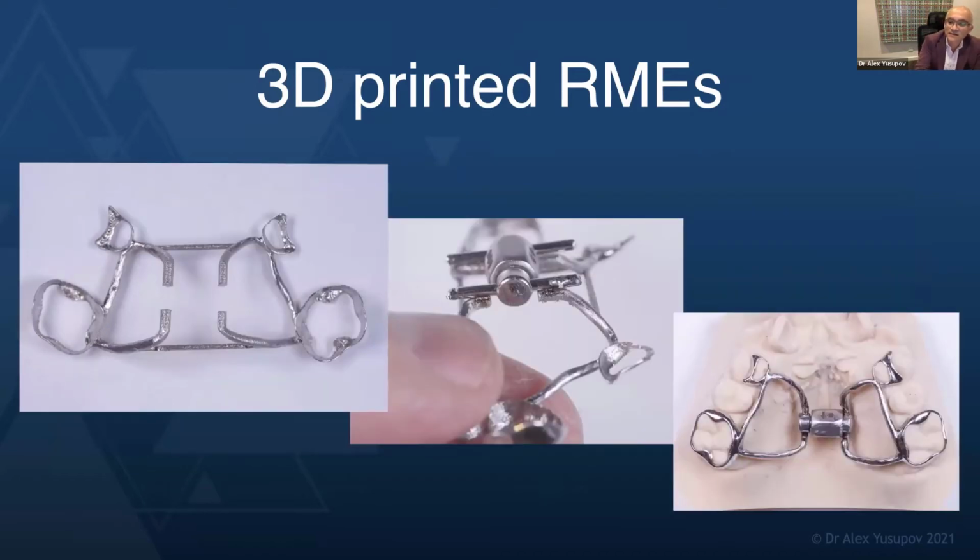So once again, this is becoming just so easy. You know, it takes about 5 to 10 minutes to get this framework done once we've got all the 3D printed parts.